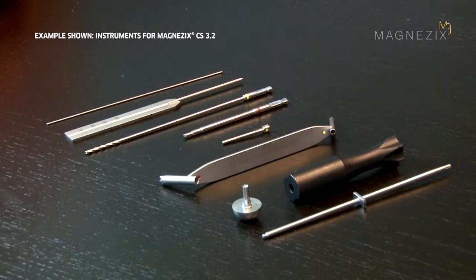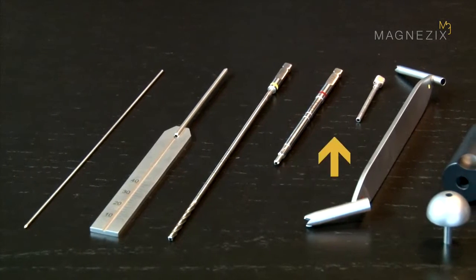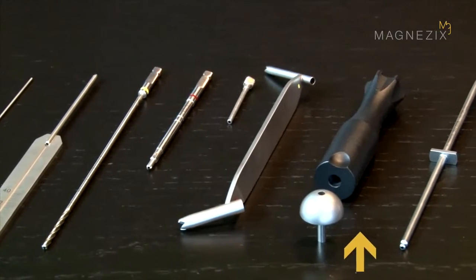You will need the following instruments to implant a MAGNEZIX compression screw 3.2: a guide wire, the measuring device, the cannulated drill bit, the cannulated countersink, a small insert drill sleeve, a double drill guide, and the screwdriver.